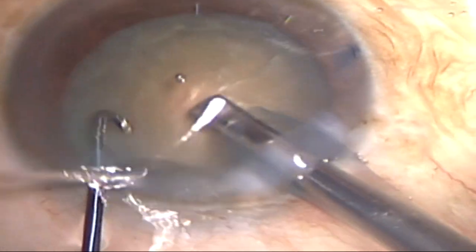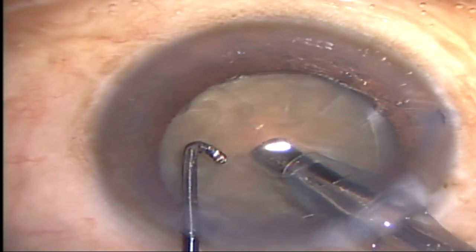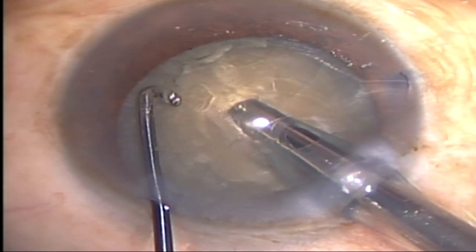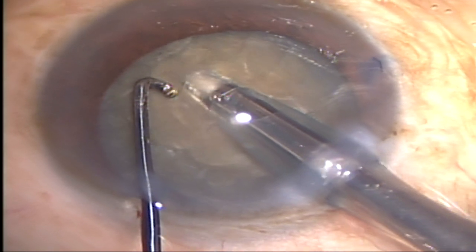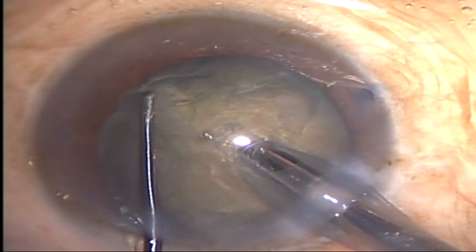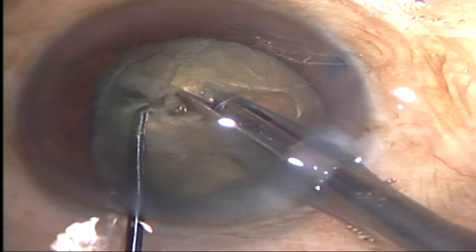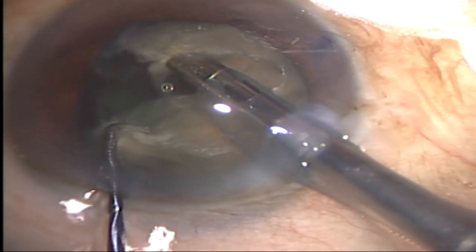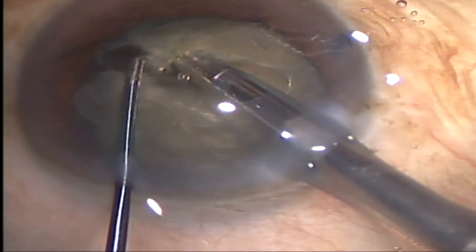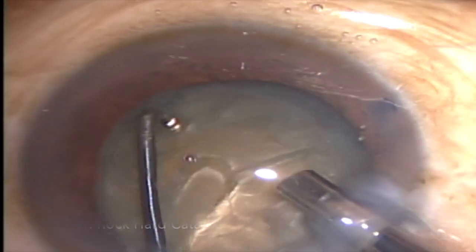Here you can see in this video: I'm impaling the nucleus with the FACO probe from the center towards the equator superficially, trying to hold the nucleus just within the equator. I've drawn the nucleus a bit and then this device is hooked around the nucleus. When I'm drawing it, you can see the nucleus is already cracked and I just simply split it, getting a complete full-thickness segmentation of the nucleus into two complete hemi-nuclei.